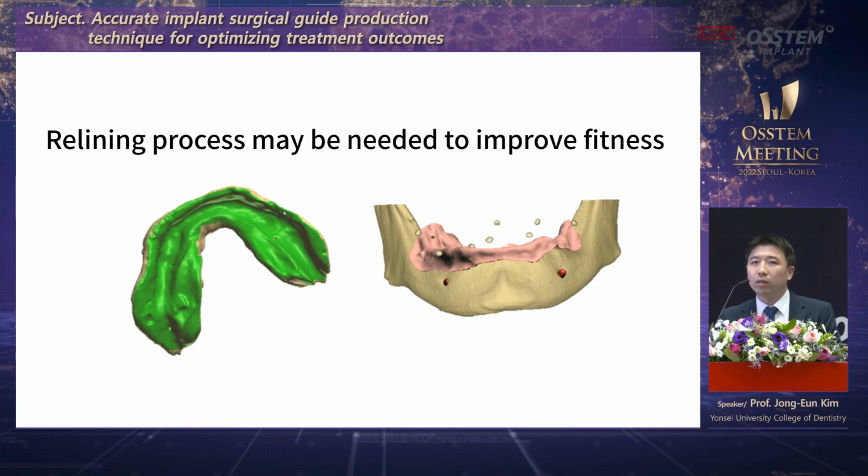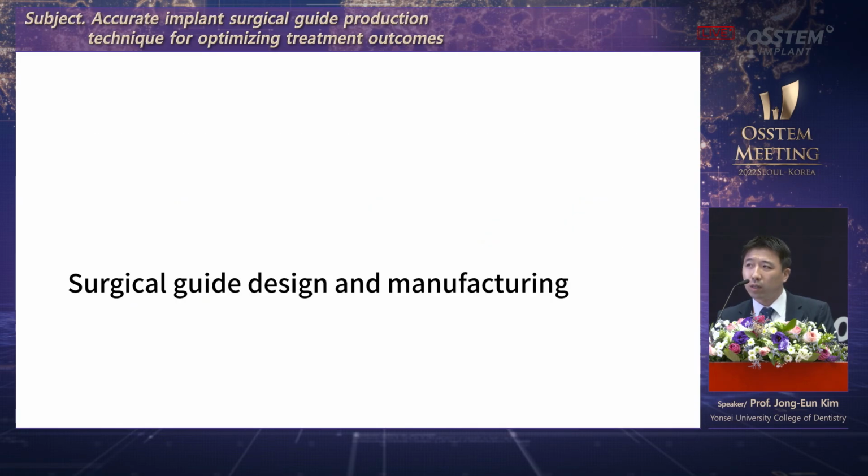You need to see the wear on artificial teeth, and there are many things to check. If the old denture is inappropriate, you need to make a temporary denture and start from scratch.